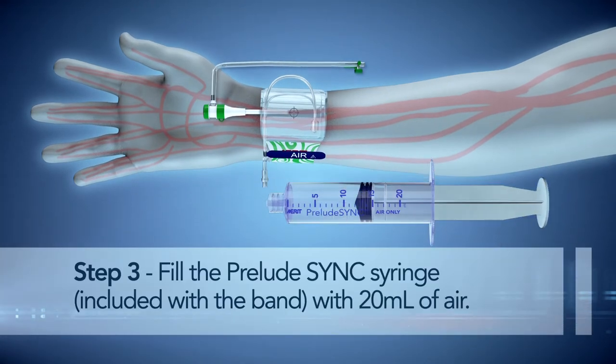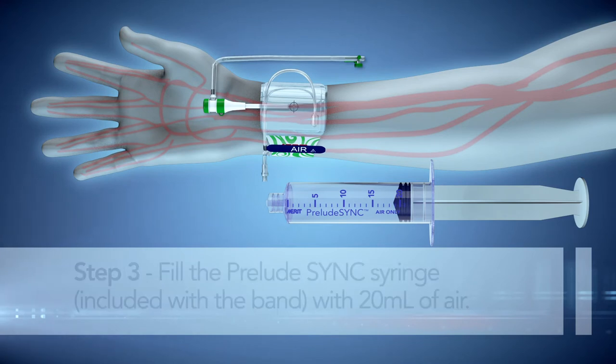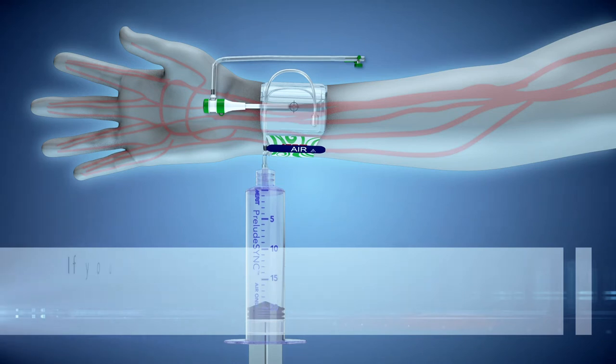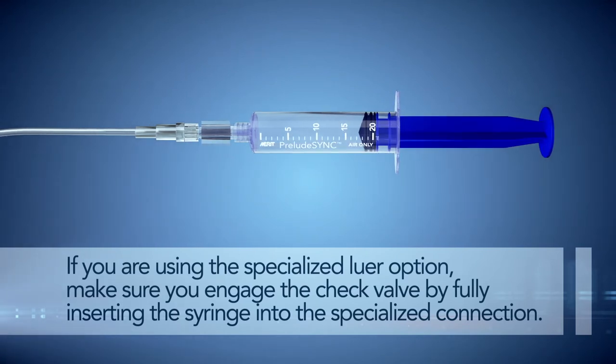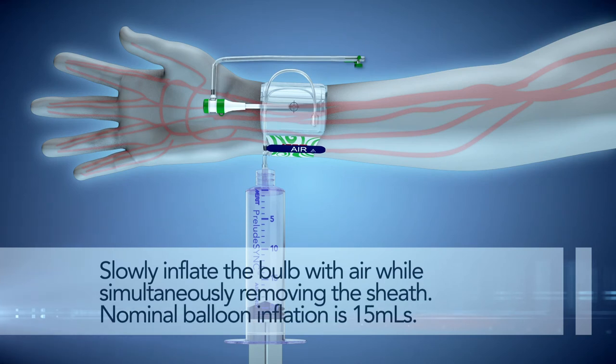Step 3. Fill the Prelude Sink syringe included with the band with 20 ml of air. Attach and completely engage the Prelude Sink syringe to the tubing line labeled air. If you are using the specialized lure option, make sure you engage the check valve by fully inserting the syringe into the specialized connection. Slowly inflate the bulb with air while simultaneously removing the sheath.